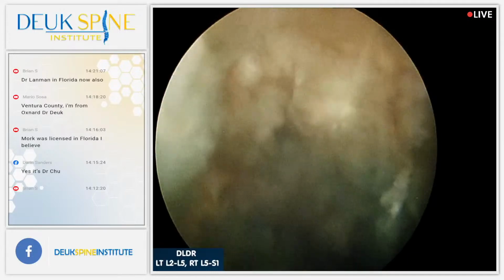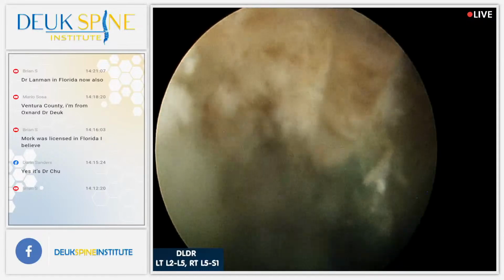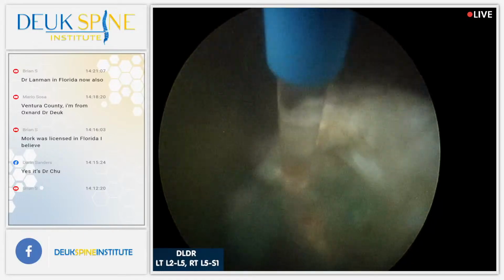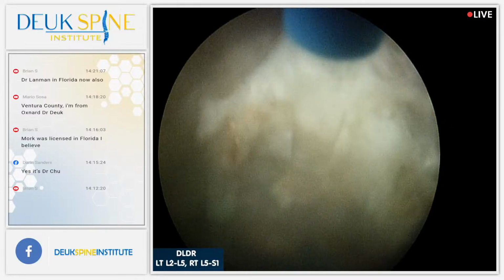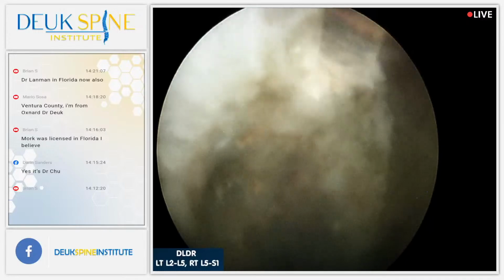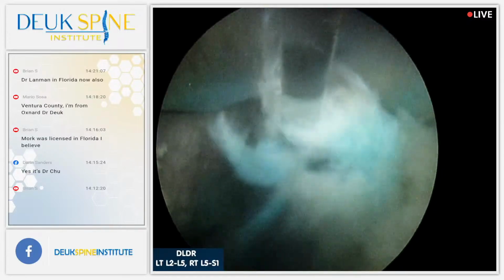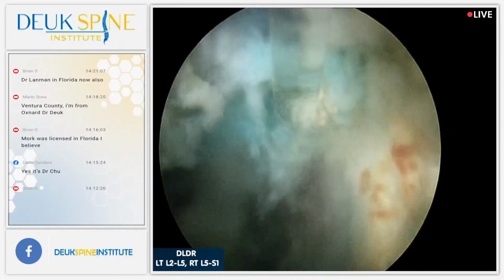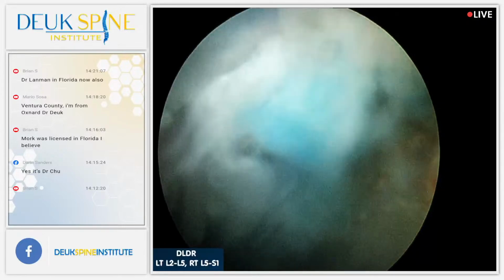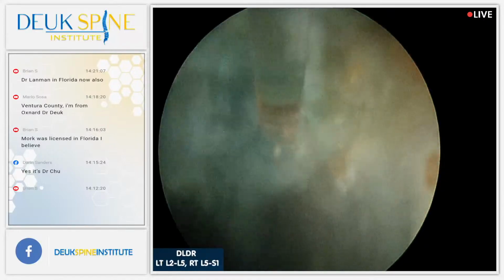If you look at the blue towel that I'm working next to right here on the surface of the patient, we'll look at it later, but you'll see lots and lots of little pieces of herniated disc in it. Okay? They all floated out. That's usually when I do my Pennywise imitation. They all float. This is a piece of herniated disc too. The blue stuff is degenerated disc.